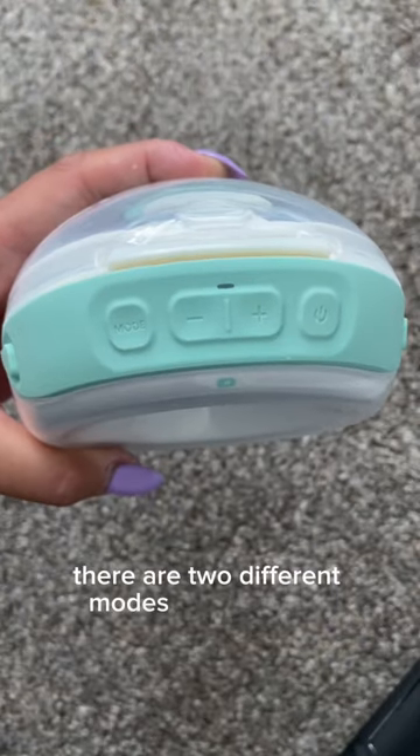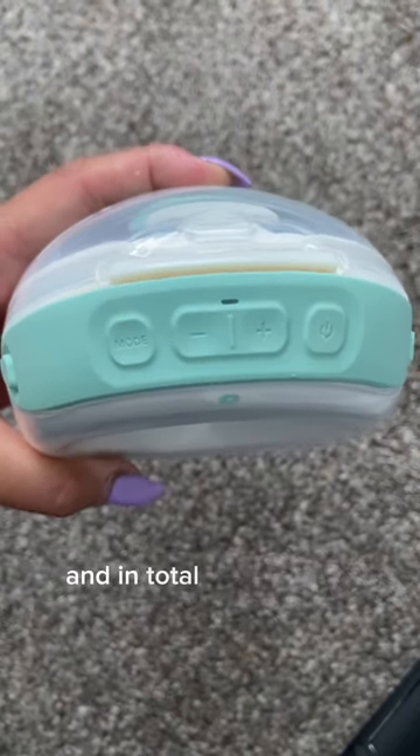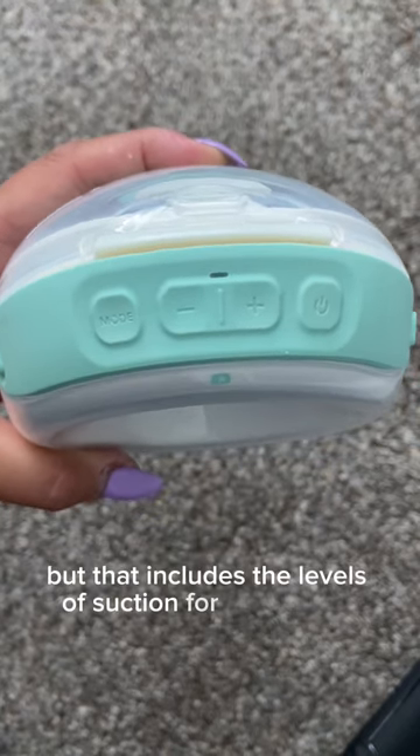There are two different modes on this pump: a stimulation mode and an expression mode. In total, there are 15 levels of suction, which includes the levels of suction for each mode.